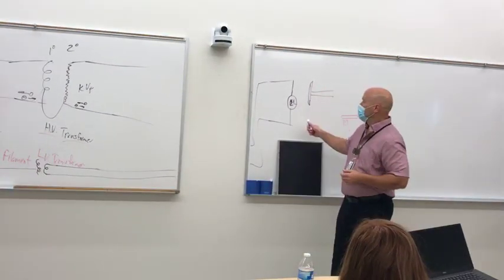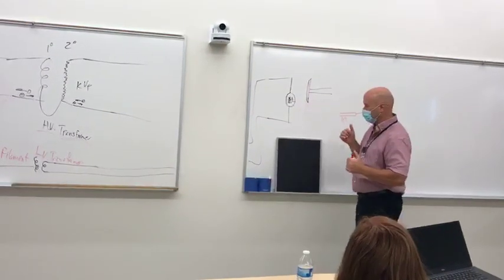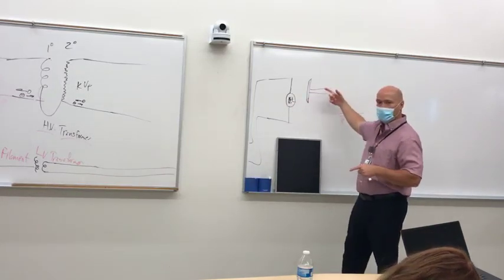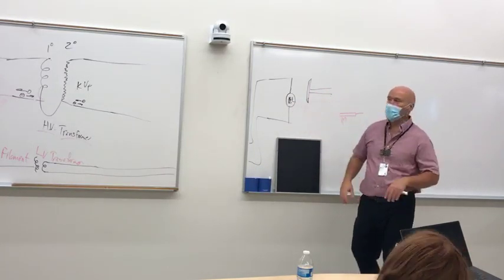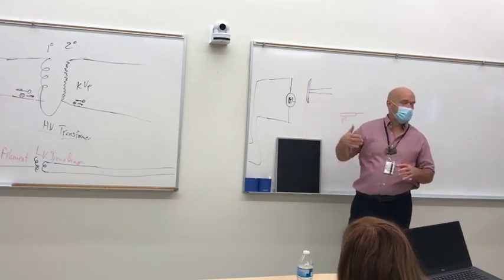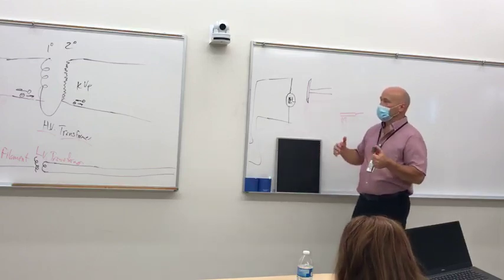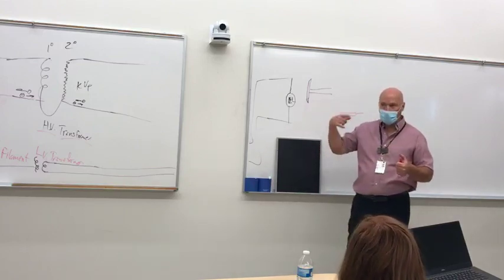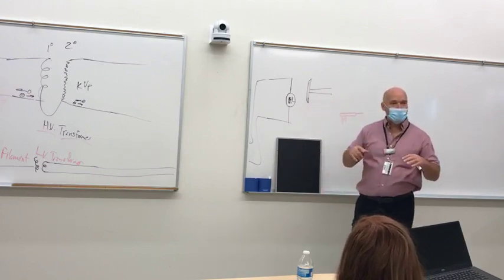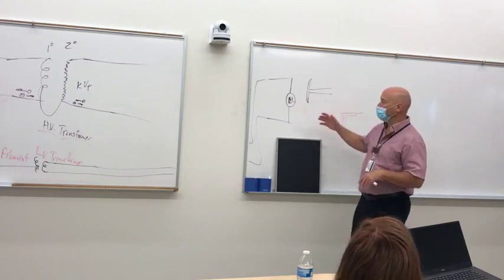All right? Perfect. So when I'm ready to create X-rays, I've hit my prep button. The prep button lights this up, spins this, and gets it ready to make an exposure. It takes about a second for this to get up to speed. You can't make an exposure until it gets up to speed. So you hit the prep button, you hear the machine wind up, and what you're actually hearing is it settles, it kind of goes zzz, like that. It's ready to make an X-ray.